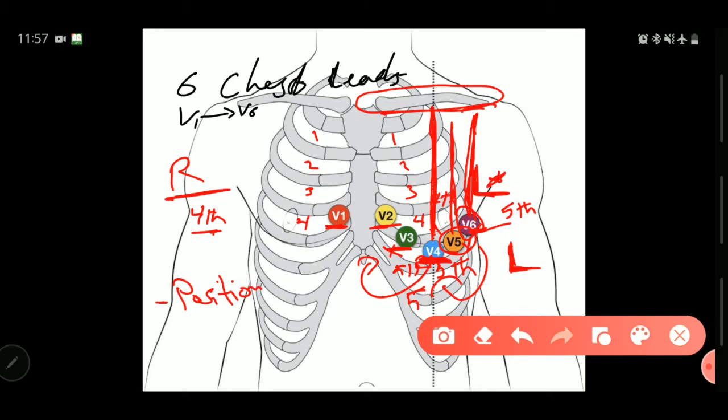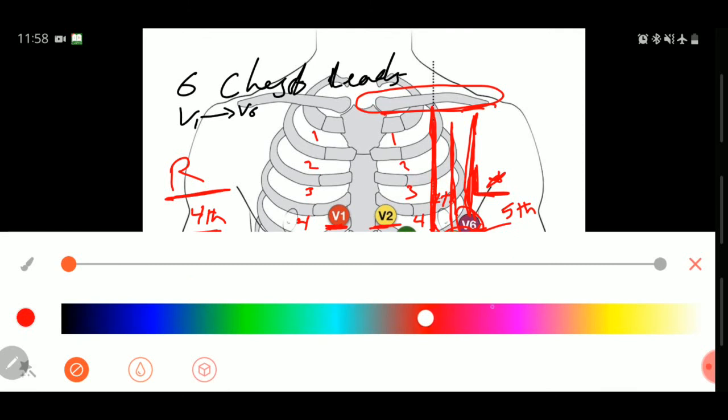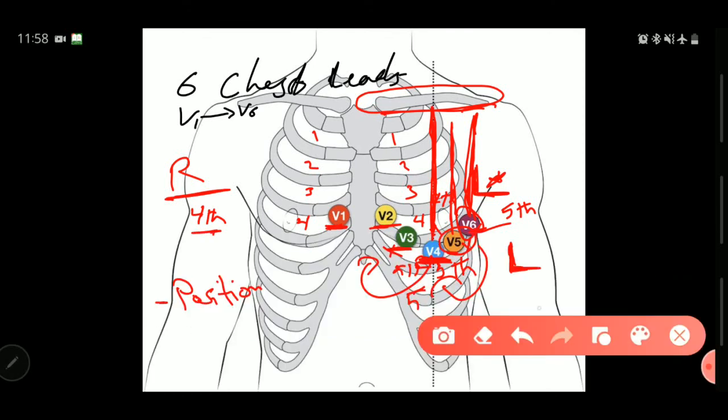Sometimes when you get to the ED, the emergency department, when you see the electrocardiograph, sometimes you don't see V number 1, V number 2, V number 3 to V number 6. Sometimes you don't see those numbers on the electrode, but sometimes you do find colors like the 3 augmented limb leads. You do find colors instead of numbers. So the colors are also so important.